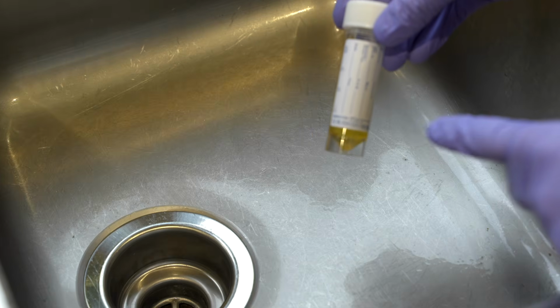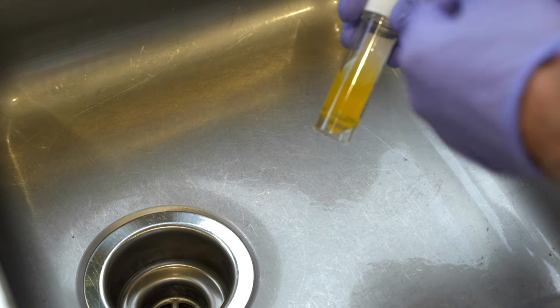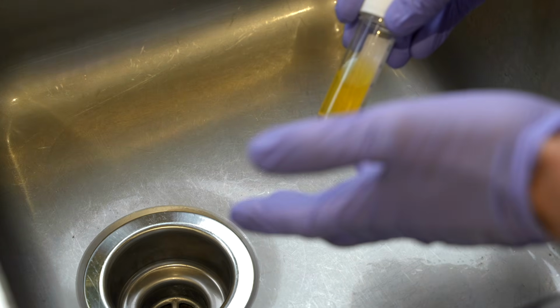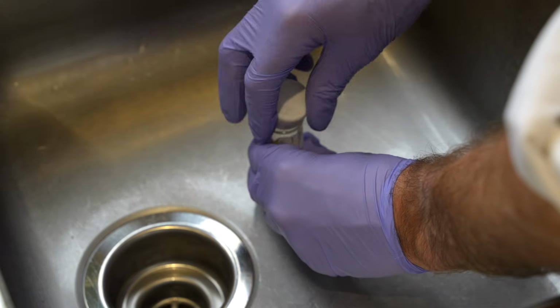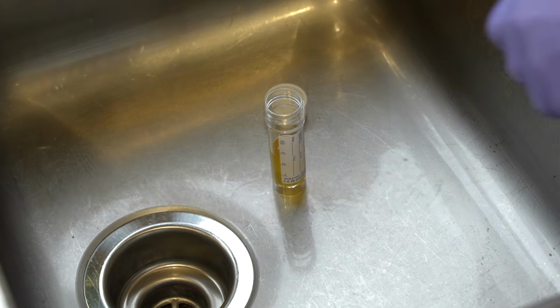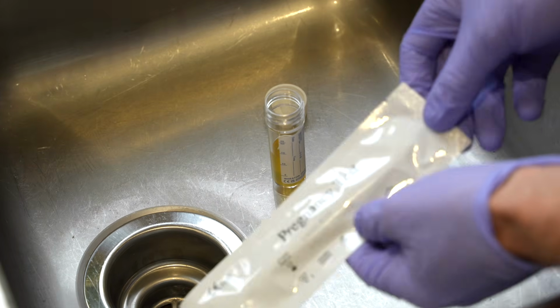So we're going to apply the pregnancy test to the urine sample, and we're going to watch for the control line to appear. So in terms of doing the pregnancy test, we've made sure that the sample is from the correct person. In this particular case, the patient has handed it to me. So I'm going to open the top, the clinical sink. Again, we're double checking that the pregnancy test is in date and sealed.